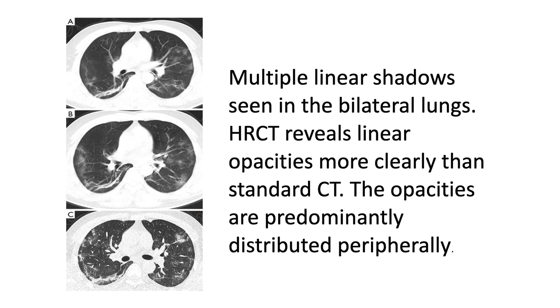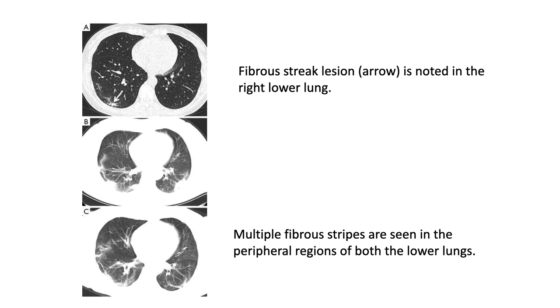Coming to linear opacities and fibrous streaks. Multiple linear shadows are seen in bilateral lungs; HRCT reveals linear opacities more clearly than standard CT. They are predominantly distributed peripherally. There are also nodular opacities present. Fibrous streak lesions are seen in the peripheral regions of both lower lungs.